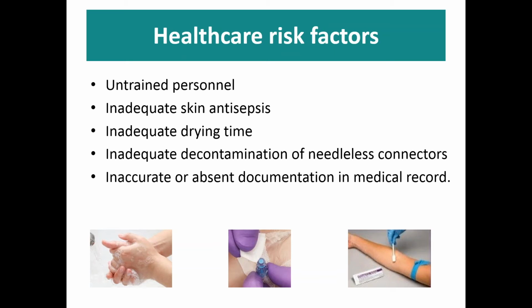Inadequate decontamination of needleless connectors is a big healthcare risk factor. Needleless connectors were introduced into clinical practice to minimise the risk of needle stick injury. They're used on almost all intravascular devices nowadays, and they provide an easy access for infusion connection. However, colonisation of needleless connectors is a major cause of post-insertion catheter-related infections. Many guidelines recommend scrubbing the needleless connector hub to minimise the risk of microbial contamination.